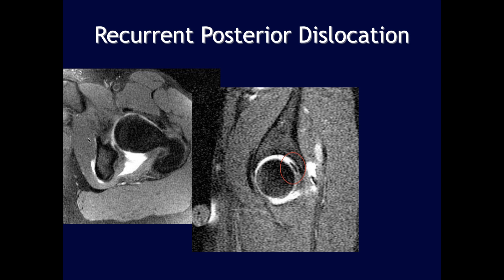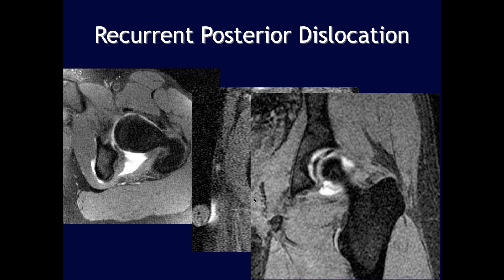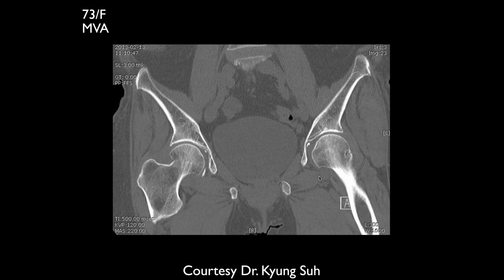Regarding the capsule posteriorly, there is no well-defined capsule, though there is some contrast. On the sagittal image, low signal intensity material on the posterior superior joint is identified — possibly displaced periosteum, displaced labrum, or a fracture. It appears to be a chronic fracture.